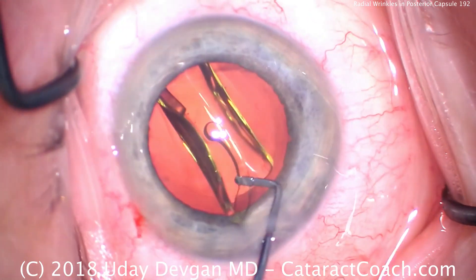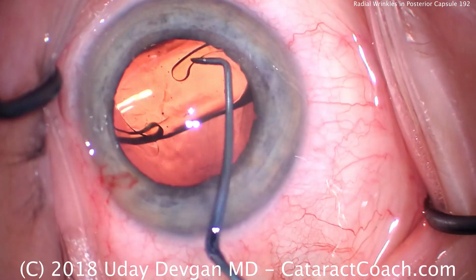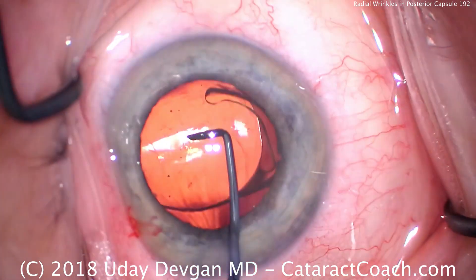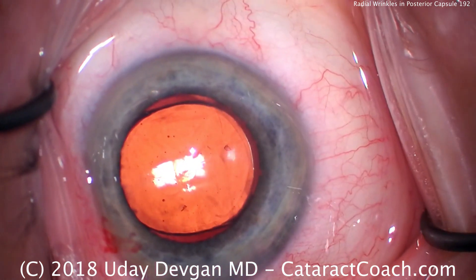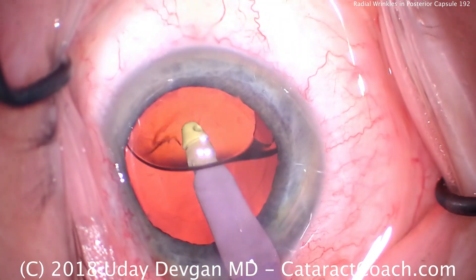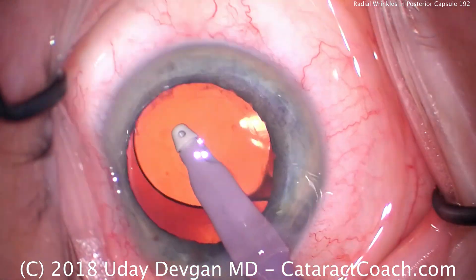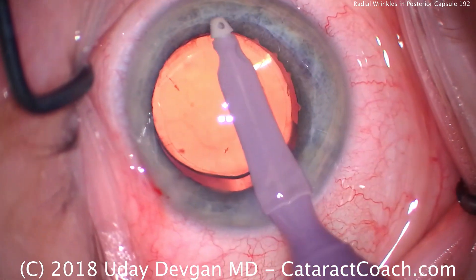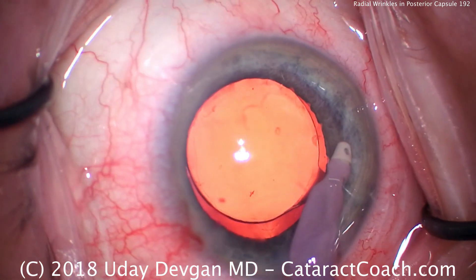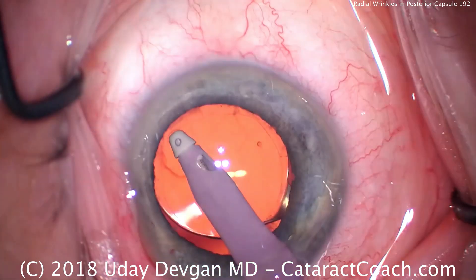You can also reflux. There's a way on most machines to use the foot pedal to reflux — to have the fluid flow backwards from the suction port back into the eye — and that can also help release a trapped posterior capsule. Most importantly, when you're grabbing the posterior capsule, don't move the probe. If you have the capsule in your port, don't lift up or move the port side to side, because that's going to absolutely rip the posterior capsule. Remember, this posterior capsule is about 4 microns at its thinnest point — that's about half of a red blood cell. That's really thin and quite fragile. You want to make sure that you respect it at all times and not cause a rupture there.